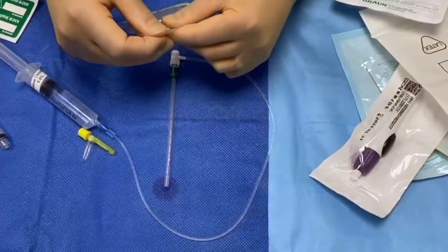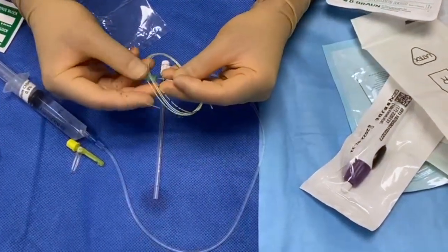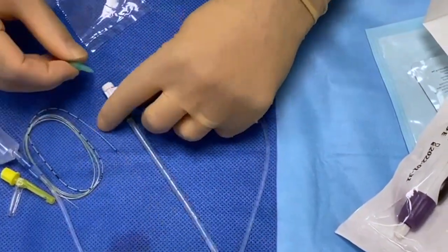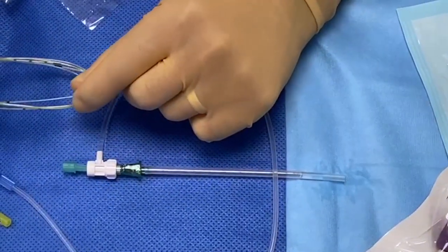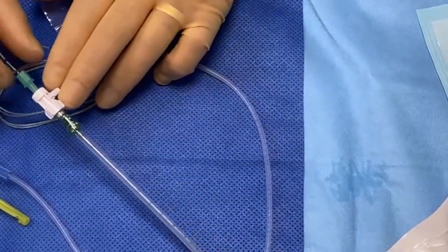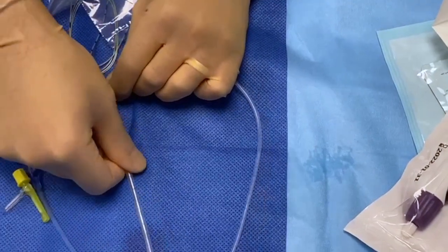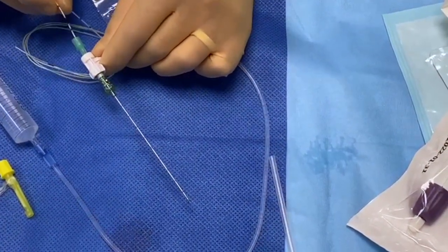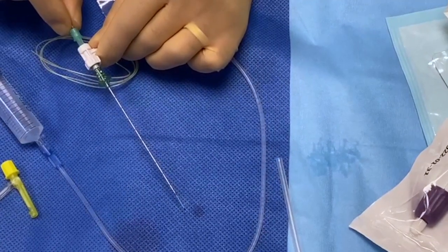The next phase is a handy tip, again fully sterile. I open the catheter from the set — you'll notice the catheter has this green attachment. This green attachment allows you to thread the catheter through the back of the needle. Place that little gizmo in there and you hear a click. You can then thread the catheter, black tip first, via this green attachment. You can see the catheter threading quite easily through it. Once threaded, remove the plastic sheath — thread the catheter up to the solid thick black line, which is 15 centimetres, and you'll see the catheter emerge from the end of the needle.